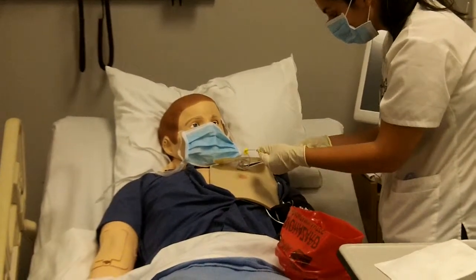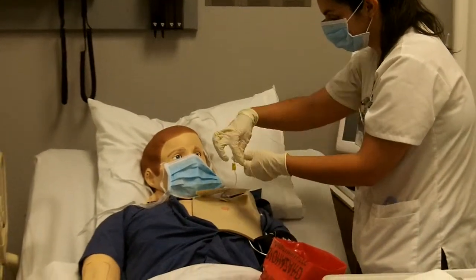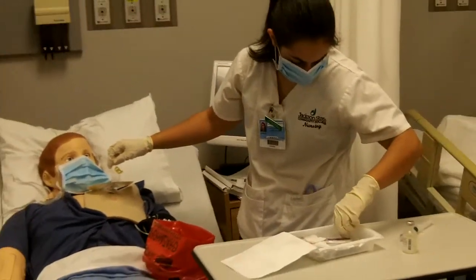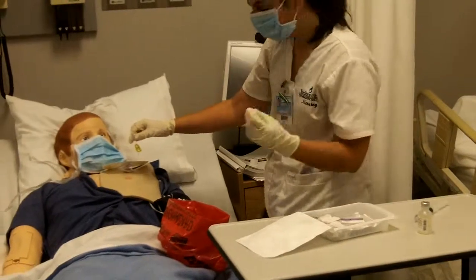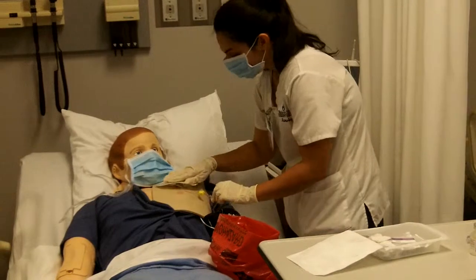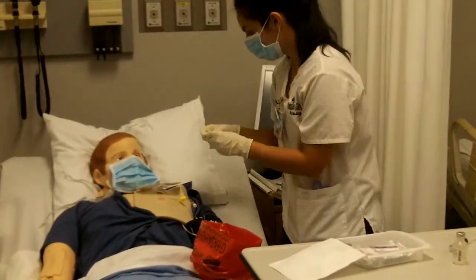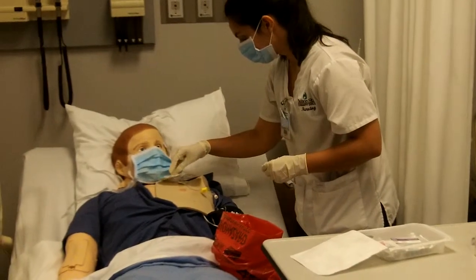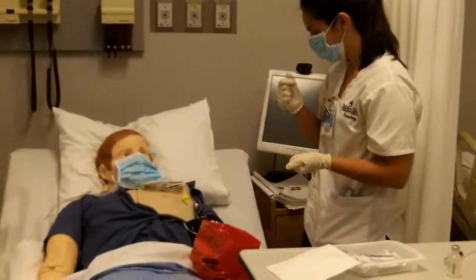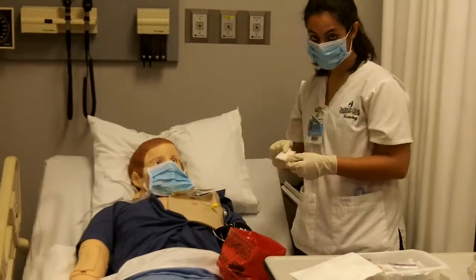I'm going to unscrew my syringe, and I'm going to replace the cap. And I'm also going to put a sticker on top of the dressing stating my initials, date, and time. And that's how you do an access of a life port.